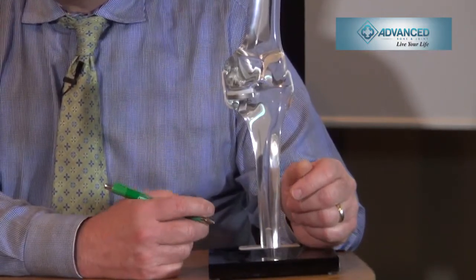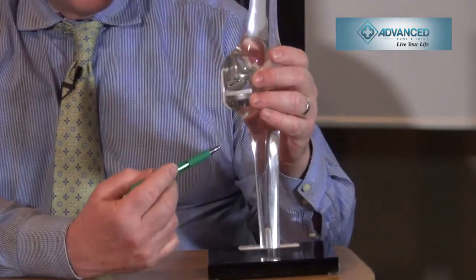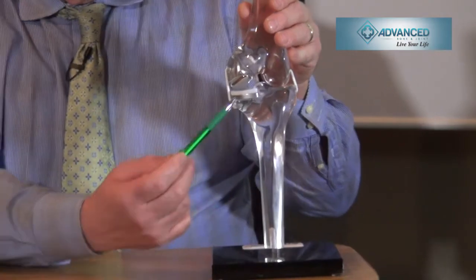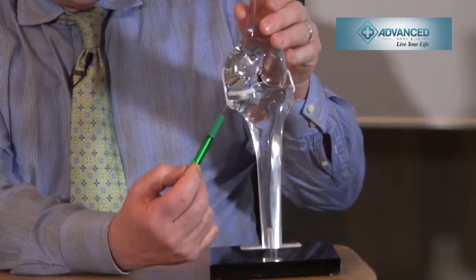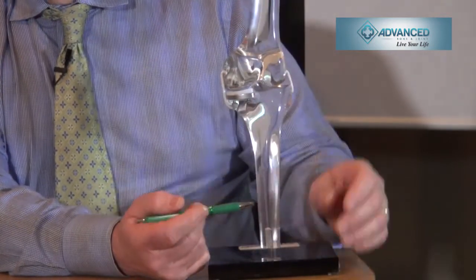Patients are very happy, and if for whatever reason after 10 or 15 years the disease or arthritis progresses to the other compartment, this can be removed and we can convert to total knee arthroplasty with minimal morbidity. We are not burning any bridges, and hopefully we can do one operation, and that will be it for the life of the patient.